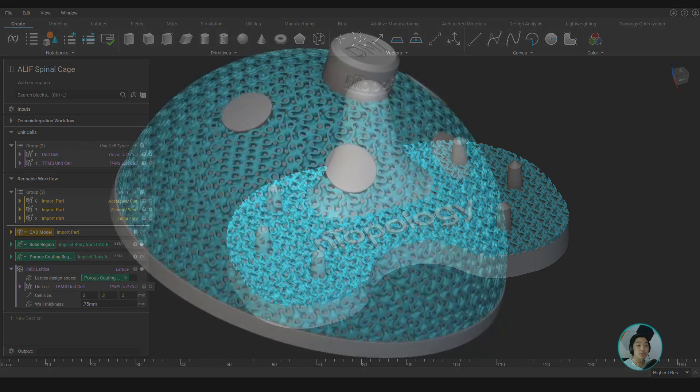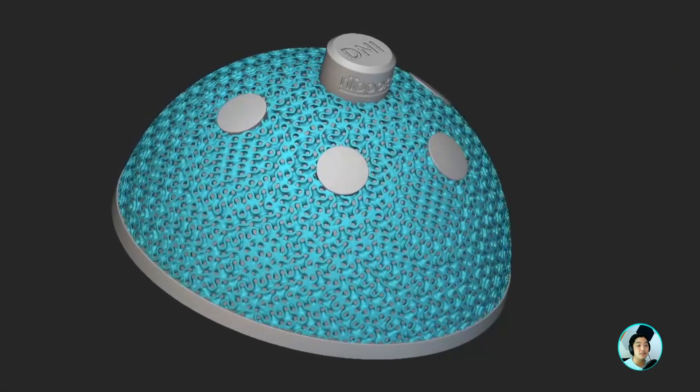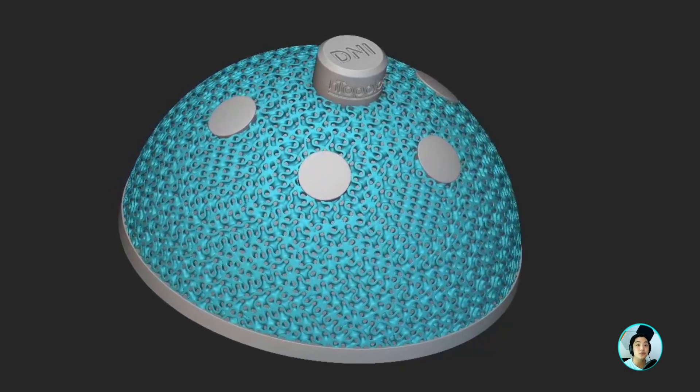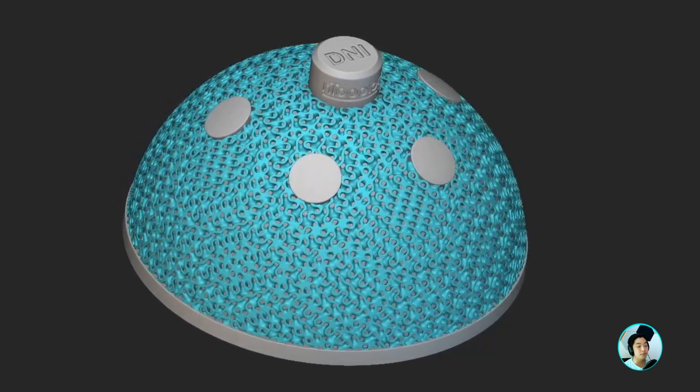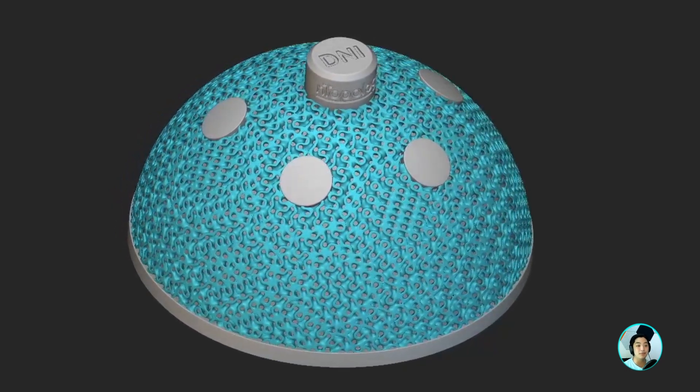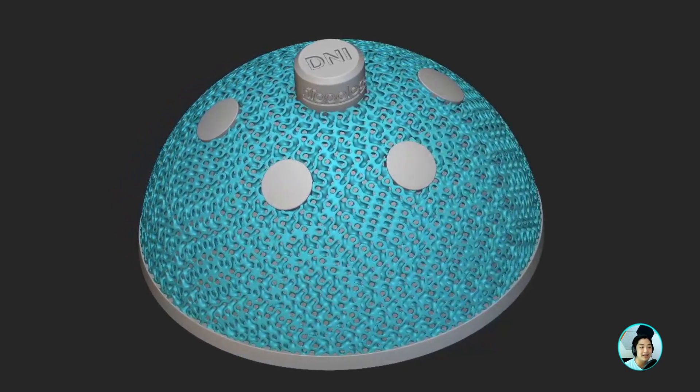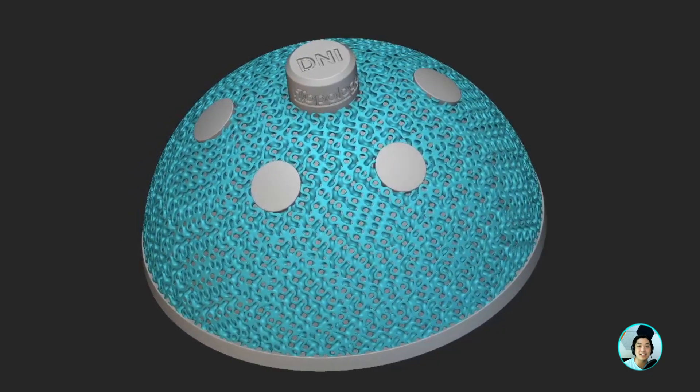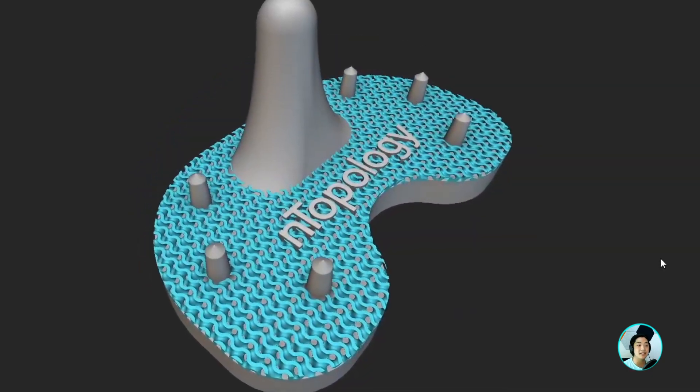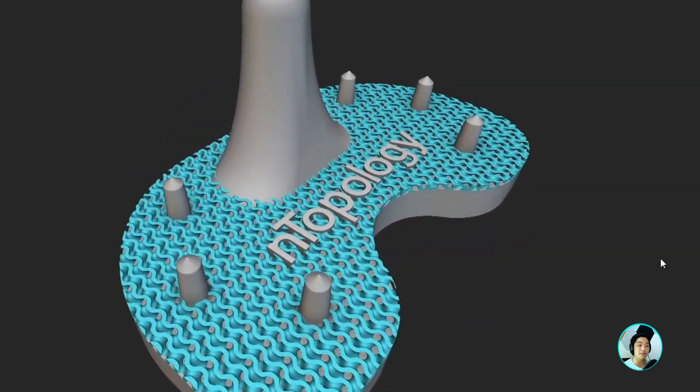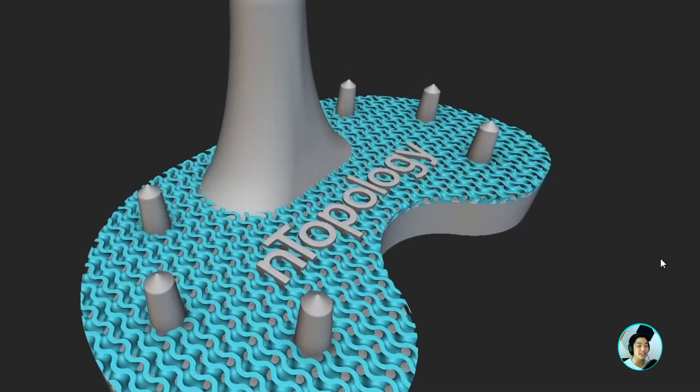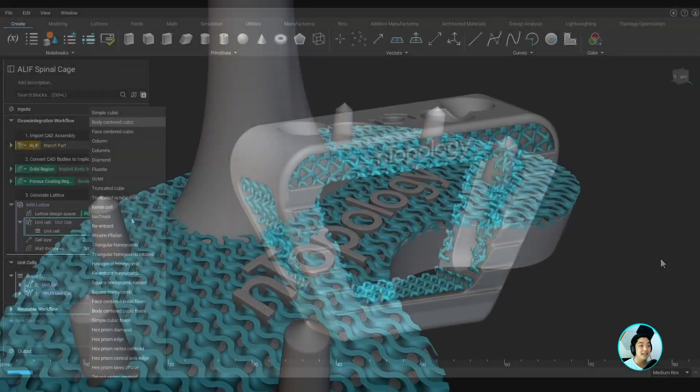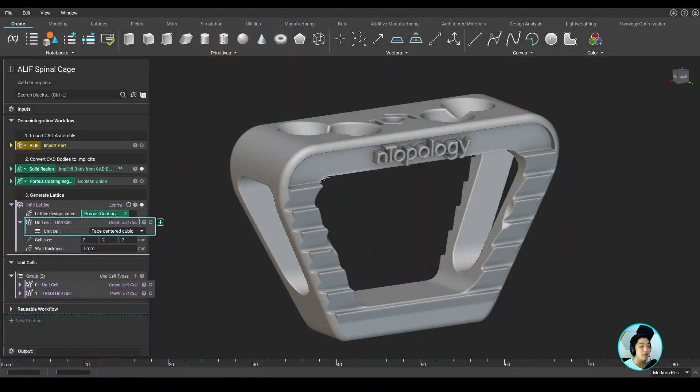The integration of lattice structures into metal implants was a major advancement to improve osseointegration, which clearly shows the huge impact additive manufacturing has on medical devices. And nTopology makes the design of these 3D printed implants much easier and faster. The takeaway here is that when you're using nTopology, you're not just designing a part.